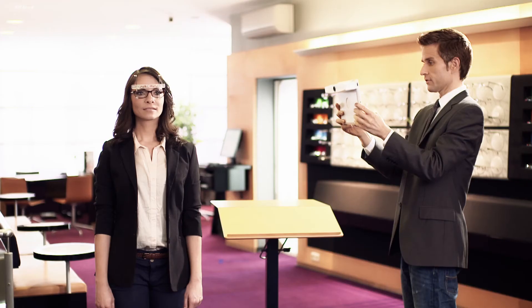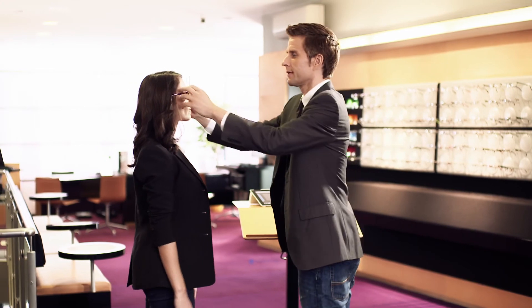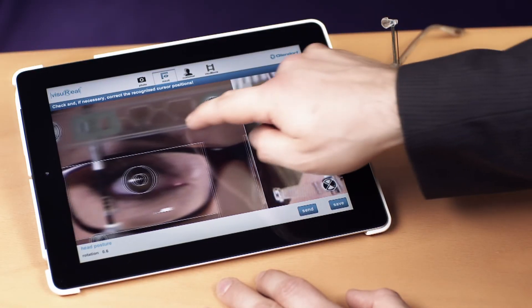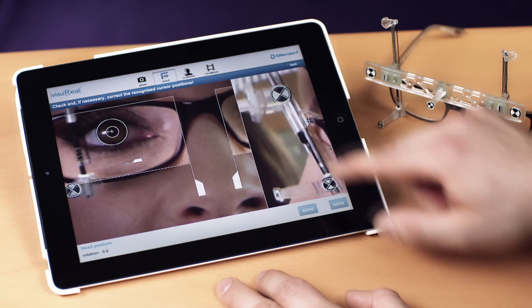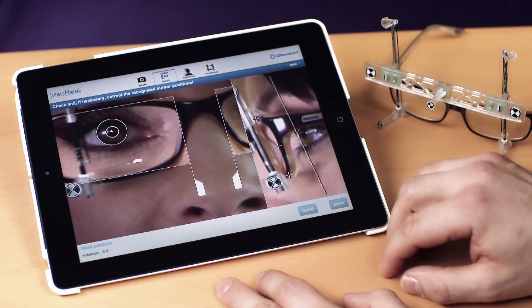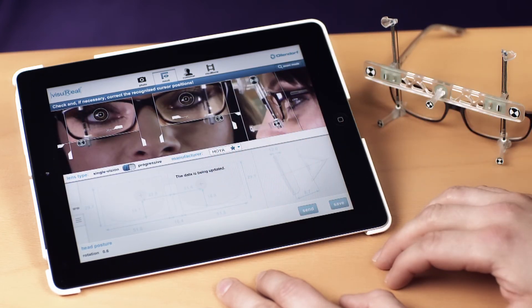Then take the picture. When you receive the first measurement results, check if all automatically detected measuring cursors are properly positioned. If not, activate the zoom mode and move the cursors. You can find information on the correct cursor positions in the enclosed quick guide.